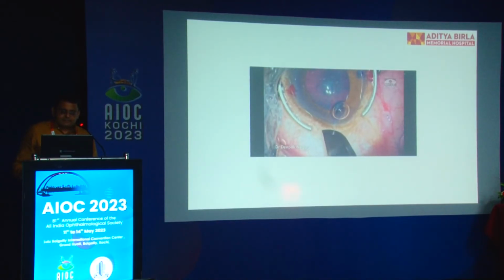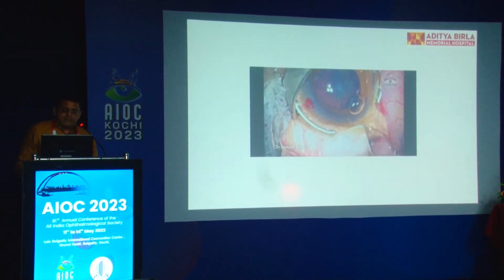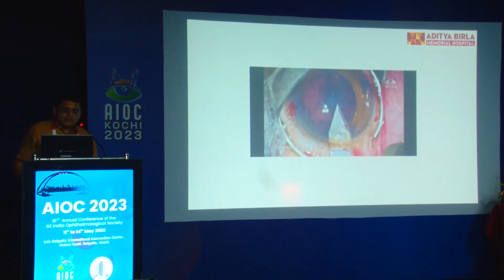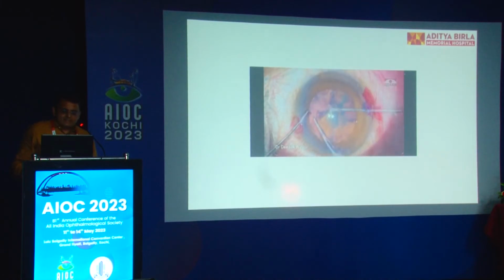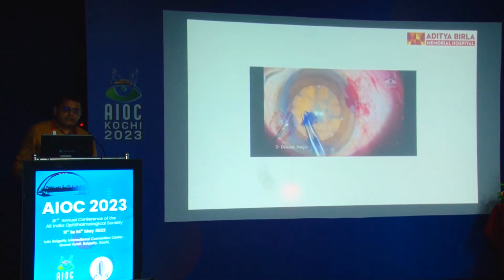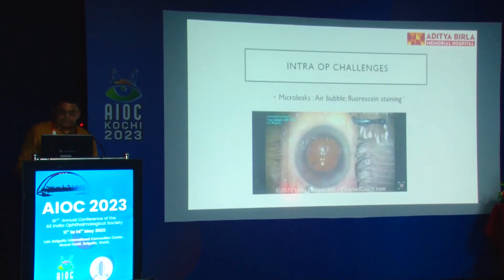For the main site, with 8 cuts, you can still go clear corneal. With more cuts, it's better to hit the sclera. The rest of the technique remains the same, except the infusion pressure should be maintained at a low level. Once the surgery is over, it is important to check whether these RK cuts have not given way. Two techniques are to put a large air bubble and keep pouring water and try to find these bubbles emanating, like what we see in tire punctures.